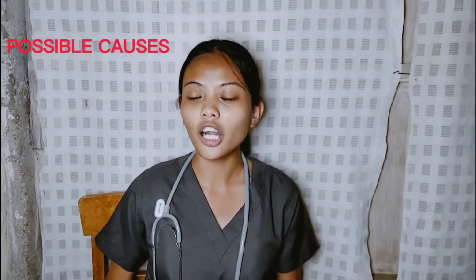So there are features that describe the fetal heart rate. If it's higher and outside the normal baseline, it is called fetal tachycardia. It is higher than 160 beats per minute.